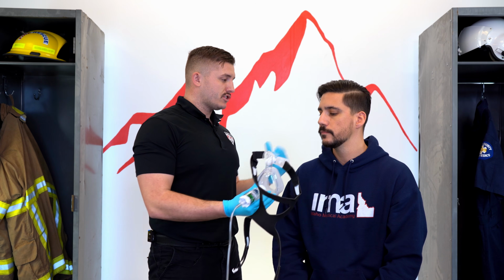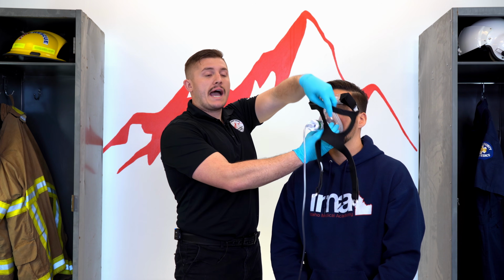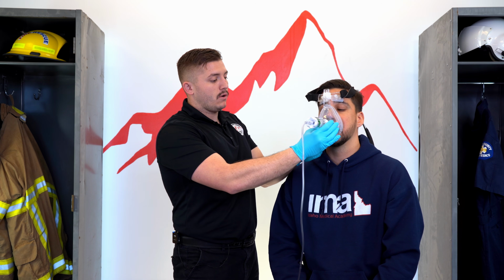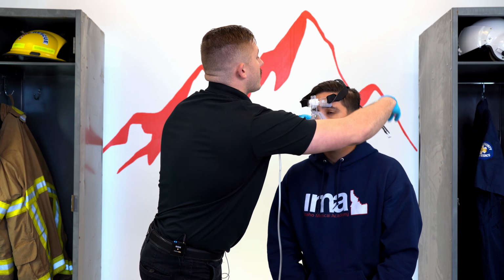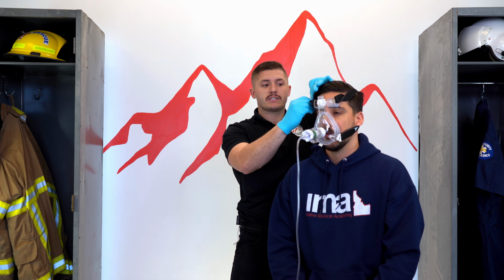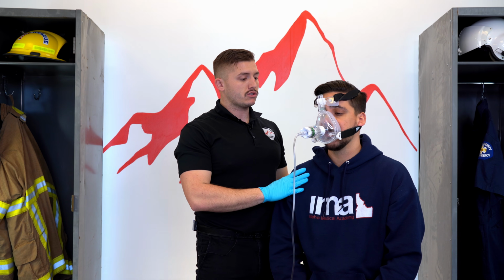You're going to take a couple deep breaths just to get used to it, okay? So I'm placing it on his face. I'm going to add some pressure. We want this to be tight. You can hear how loud it is because of how much pressure it's actually giving my patient. I'm going to place the harness on his head. And then I have these clips down low. Again, this is something you're going to have to practice with a lot to get comfortable with. And that's pretty snug. If I want it to be tighter, I can take the straps and adjust. And again, I'm just coaching my patient through this. Good, just keep taking those slow, deep breaths.